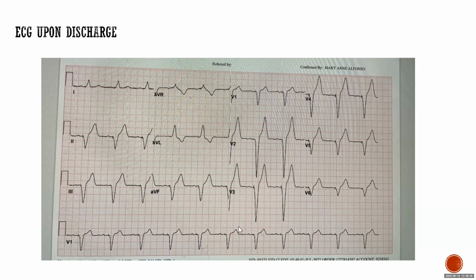Each P has a spike following it, regular P, there's no atrial pacing. The pacing spike in the ventricle is following a sensed P with the same interval. So you know the device is sensing the atrial activity.